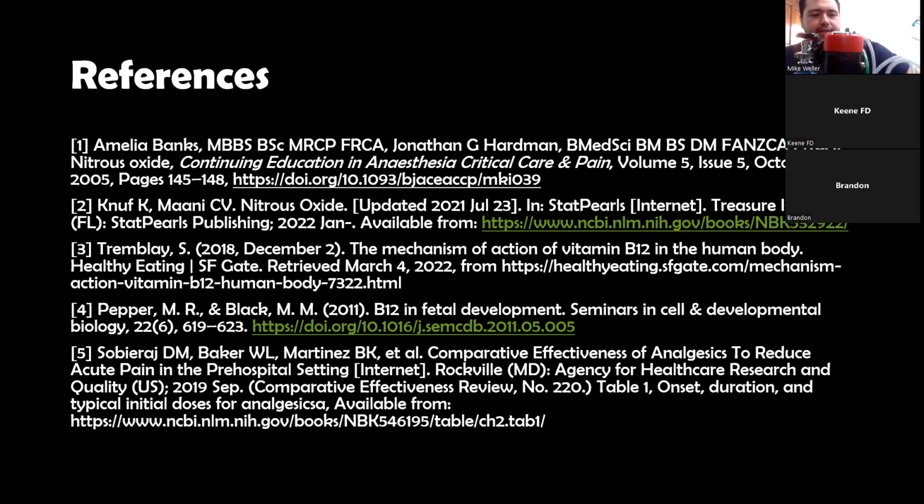So when we operate this, it's important to remember that your chamber needs to remain upright. Okay, this chamber must remain upright the entire time you're administering this medication. So you can't just put this on its side. That can be an issue when you're running in the back of an ambulance. You're not going to be able to put it on its side. It has to remain upright. You're going to go ahead, hook up your nitrous oxide tank if it's not already hooked up. Make sure that you open it all the way.